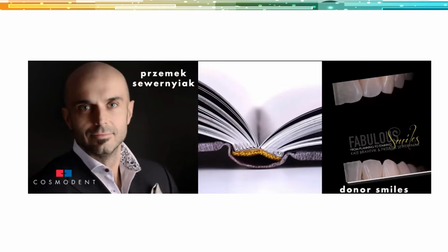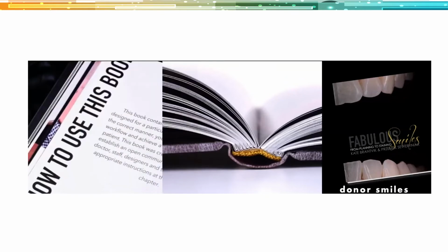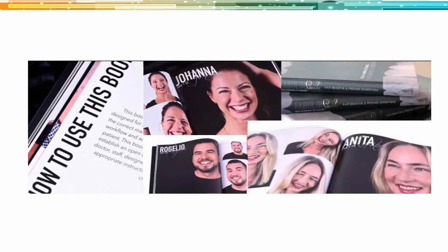And him and his wife basically digitized 18 different people of different ages, male and female, and they made this big coffee table book. And so today, what's interesting is that my digital smile design process actually starts with showing a patient the first page of this coffee table book, where you don't even see the faces, you just see the perioral zone zoomed in, and you see these different smiles. And what's interesting is that beautiful smiles are not completely symmetrical, right? There's a beauty in nature to having a little bit of asymmetry, a little bit of characterization.